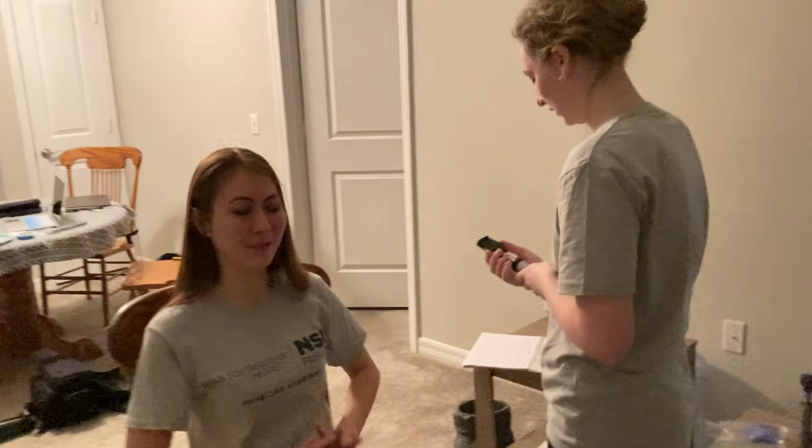Do you need a break? No, it's good. I'm okay. So sorry, it's literally my contact lens. It's not you. You just do your thing. Bringing my diopter back to 0, okay?